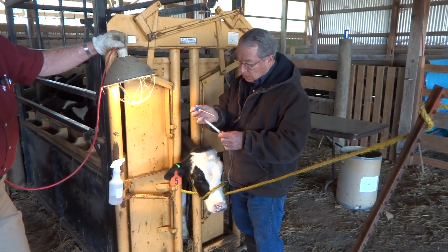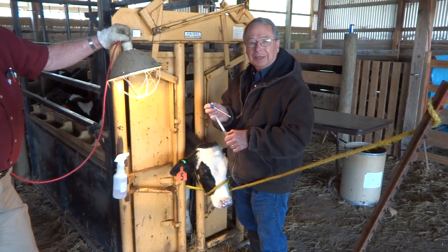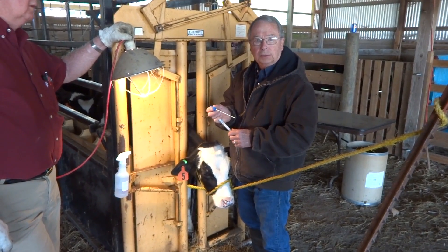I'm using an Amies transport medium sterile swab. After I take this, we are going to refrigerate it, label it, and ship it to the laboratory. We want to keep it refrigerated during the transport process.